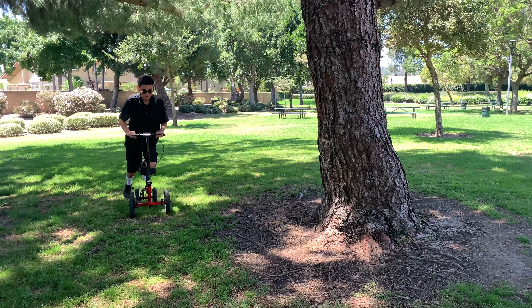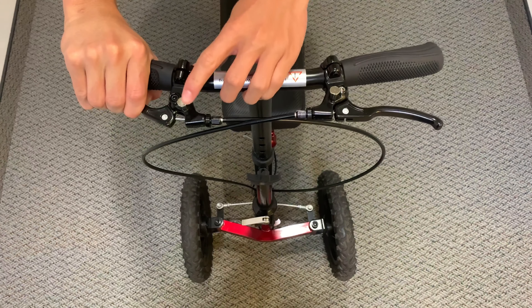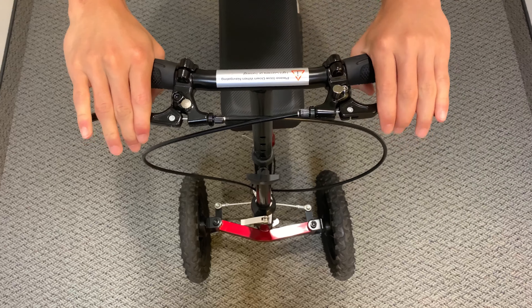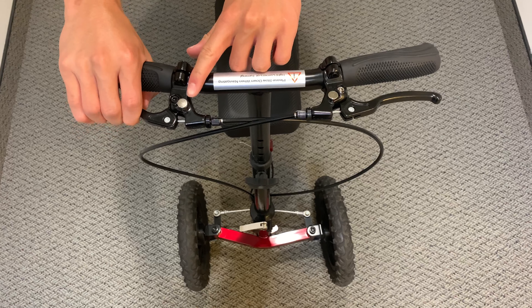The steerable front wheel allows for maximum maneuverability. The Knee Walker includes a lockable drum brake on each side based on the user's preference, keeping it in a stationary mode.